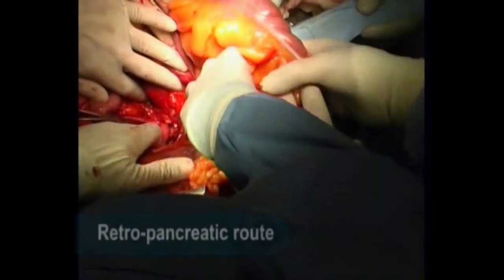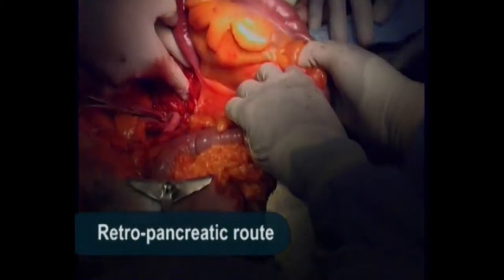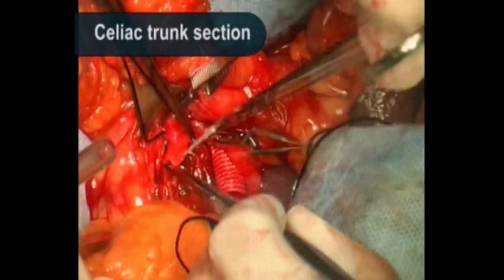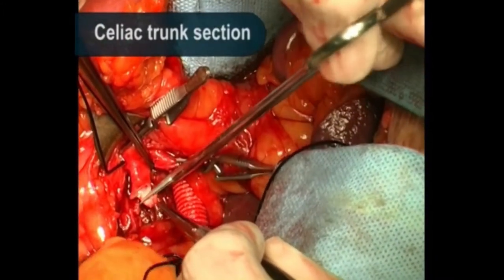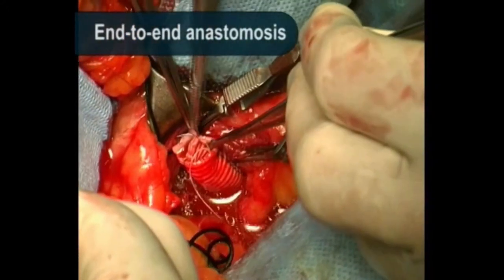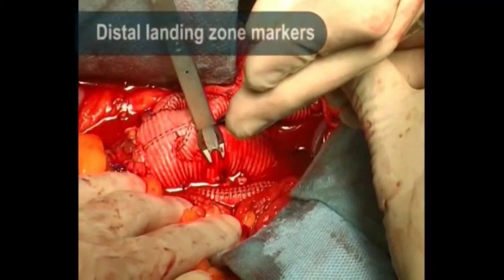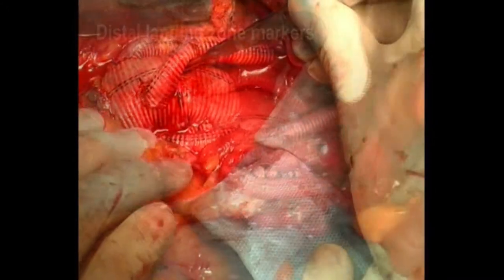The superior branch to the celiac trunk is routinely tunneled by a retropancreatic route. In this case, after ligating the celiac trunk at the origin, an end-to-end anastomosis is performed. The use of radiopaque markers may improve the accuracy of the distal stent graft deployment.